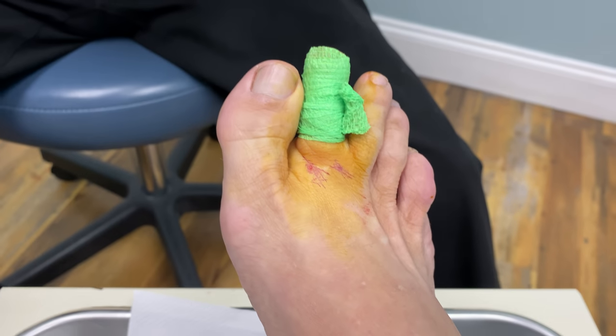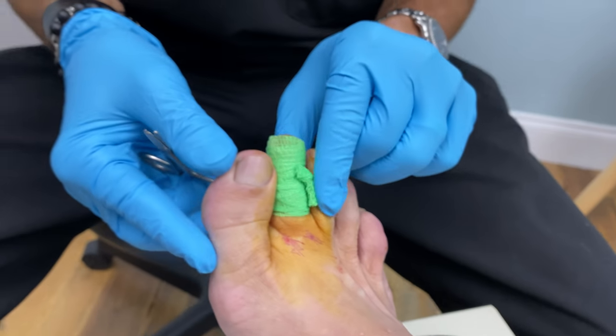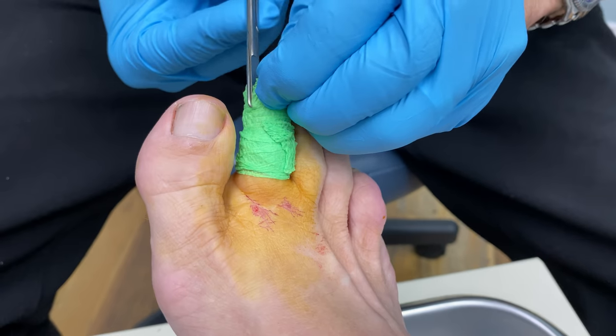So we put our tourniquet on, our toe band, and now we are going to open this up so we can see what is going on here and get this nail off.